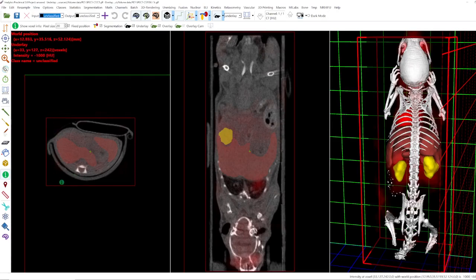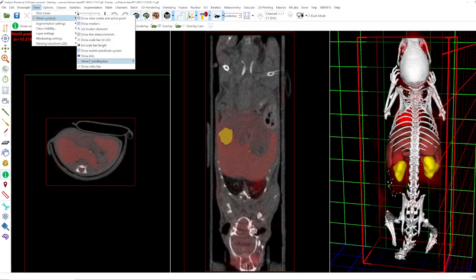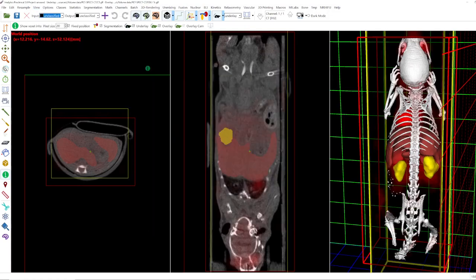This is where our underlay data is located — for example, here our CT scan. We also have a bounding box for our overlay, in this case our PET data, because the underlay and overlay data don't have the same sizes, especially when they are acquired from different imaging devices. So here we had another CT and another PET, and we can go to Show Symbols > Show Bounding Box > Overlay — now here in yellow we have the bounding box for the PET data.